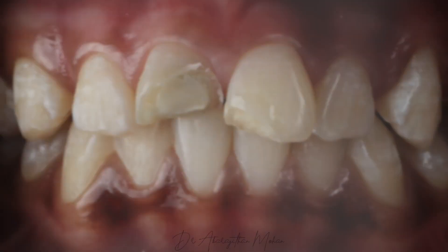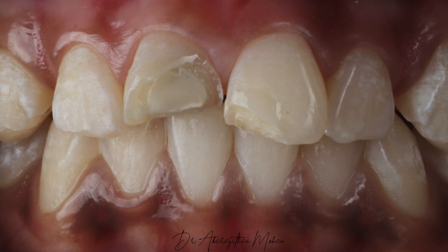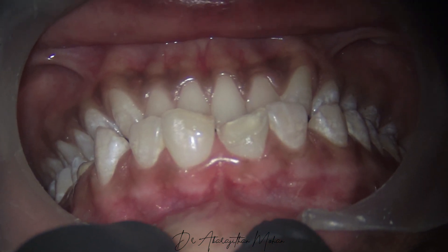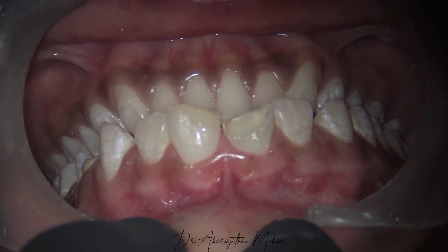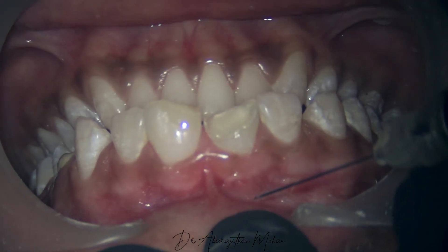We have a patient for whom I'm going to perform a veneer preparation on both the maxillary central incisors. It is very important to note that prior to placement of retraction cord, it is mandatory to anesthetize the tooth. This procedure should not be done without anesthesia.